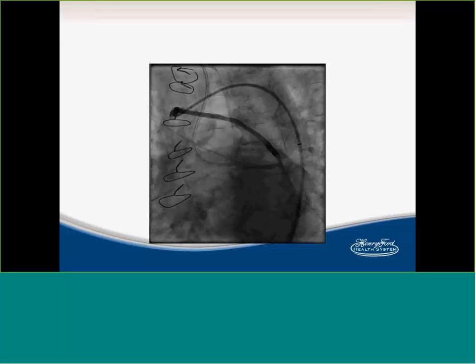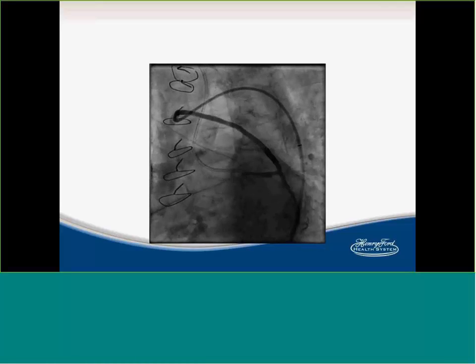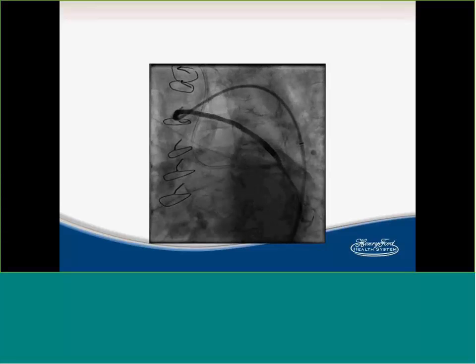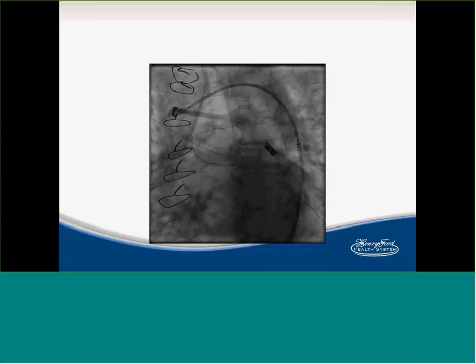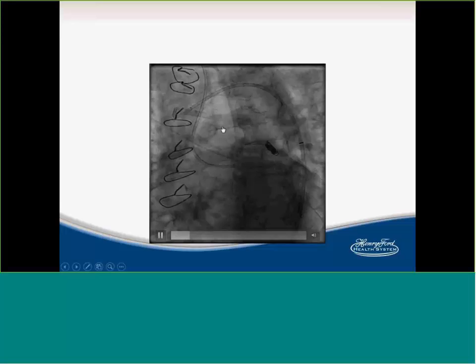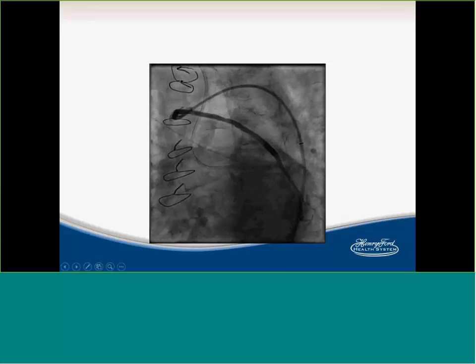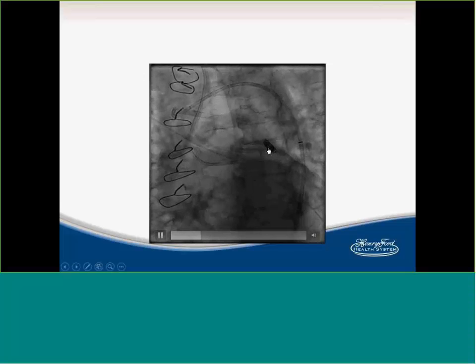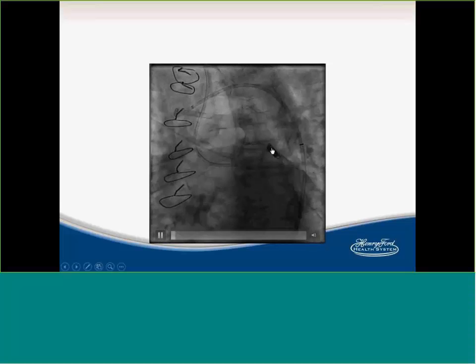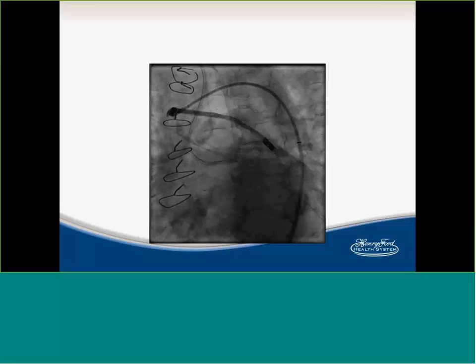Oh, okay. I think what they were saying is, do you coil all the way distally, or are you coiling also proximal in the graft, at both ends, to stop the flow? I actually just put a coil distally, and I'll let it get plugged. I don't like to fill the whole graft with coils, because those coils are going to stand in your way to do angiogram. They overlap with your native circulation, with other grafts. So I just like to coil as proximal to the distal vessel, to the native vessel, as possible. And you let it close by itself, right? Yeah, and normally those work.